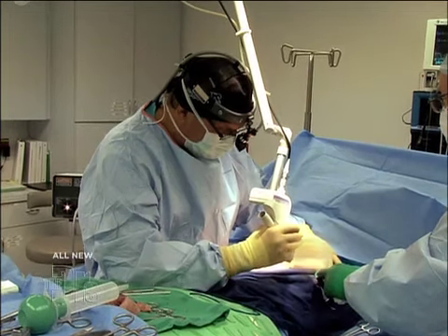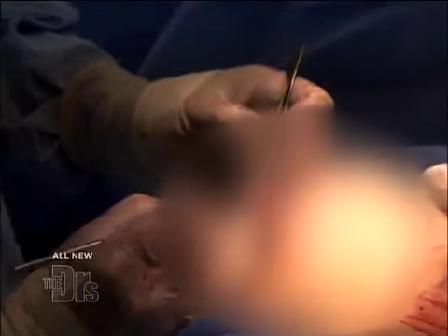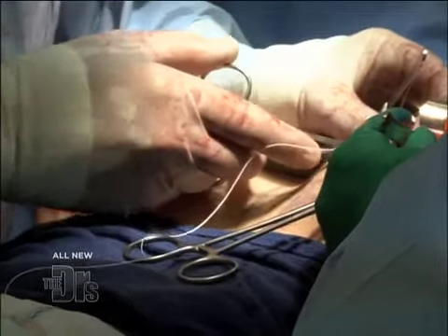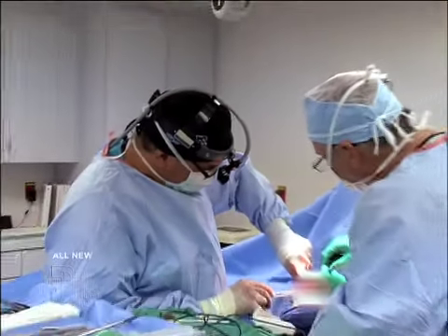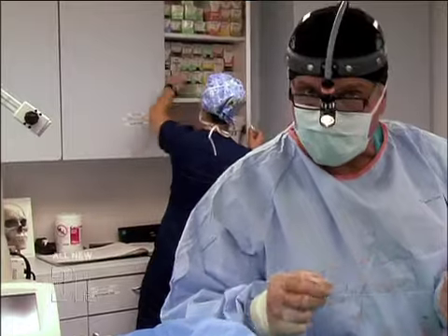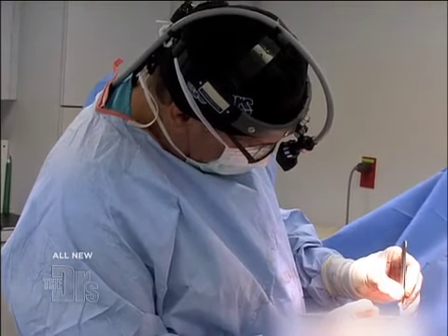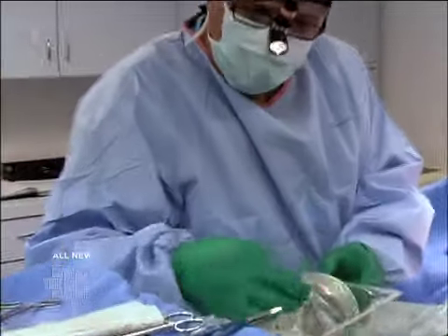This is totally different than any breast lift we've shown on The Doctors. This is the internal brassiere component. We're sewing, we're rolling her own breast tissue in, centrally fixing that to the fascia over the pectoralis in the midline. When you hear Gore-Tex, you think of your ski parka — but Gore-Tex is very durable. It's a great material to create that inner brassiere, that inner breast support.